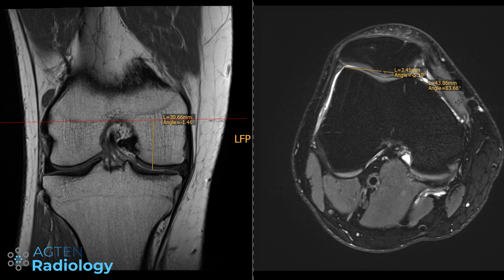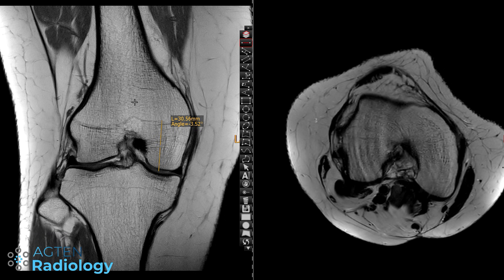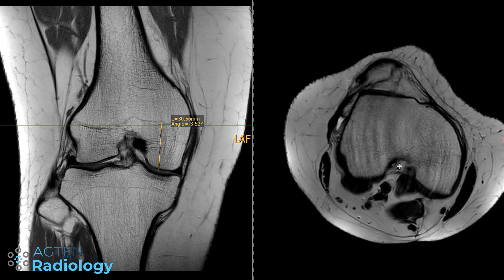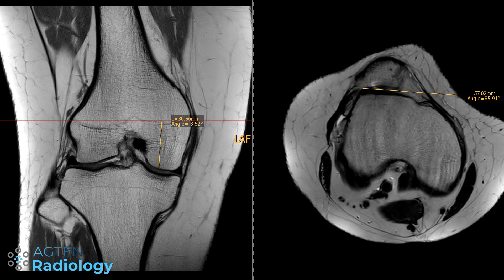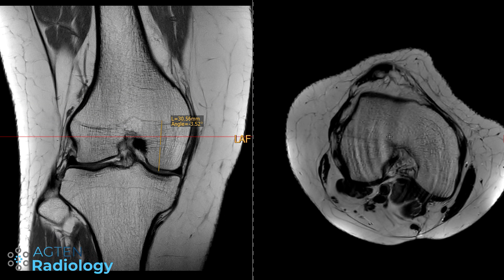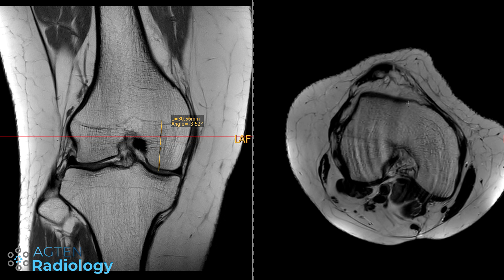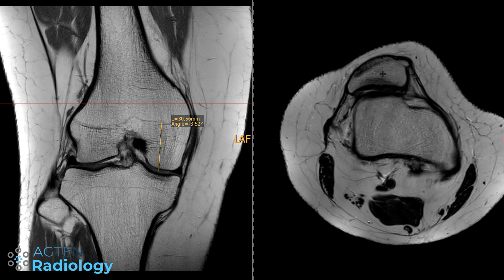If the sulcus depth is below three millimeters you have a shallow groove; above three millimeters you should not have trochlear dysplasia — as in the normal patient shown here. In a dysplastic case, we again go three centimeters above the femoral tibial joint line and scroll to the corresponding transverse section. With severe hypoplasia or aplasia of the lateral facet there is essentially nothing to measure, and you can immediately see that this is a severe patellofemoral joint dysplasia.